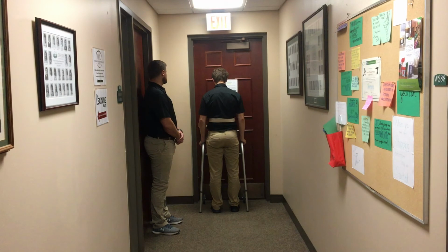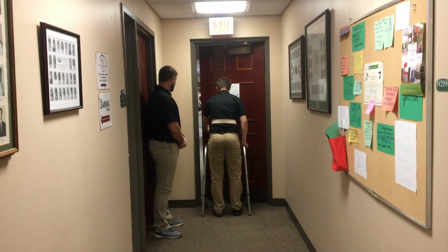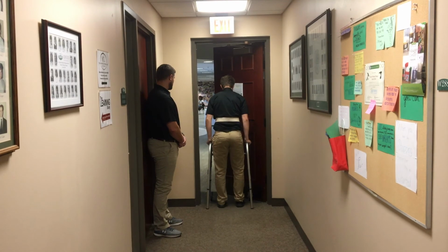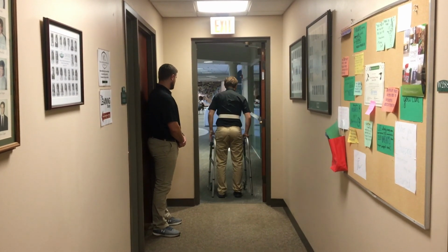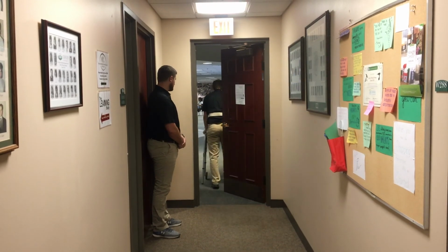Instruct the patient to stand directly in front of the door and have the patient shift the weight into the hand away from the door handle. With the free hand, push the door open as before and use the walker as a doorstop on the door side. The patient will then step into the walker and continue this process until completely through the swing arc of the door.